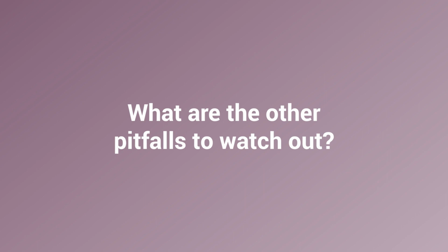So, okay, we know those three biggest pitfalls. What else? Are we good to go, or is there anything else? The next one that comes to mind is not thinking ahead towards validation. Sure, it's great if you understand your data and you've trained some model, but how are you going to know whether it's a good model? The first thing in the machine learning world is that you need to be sure your data, even your training set, you want to split into different subsets.